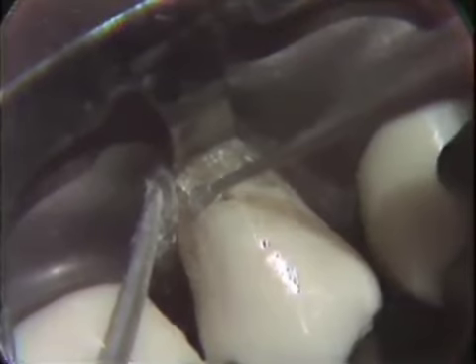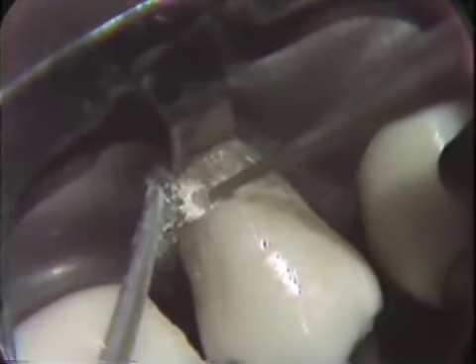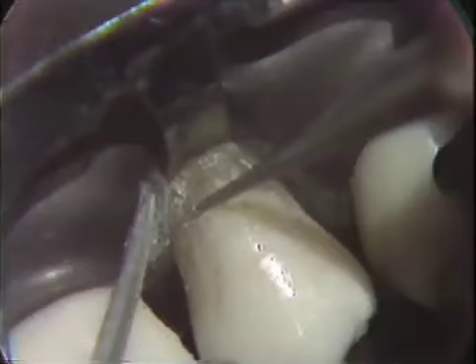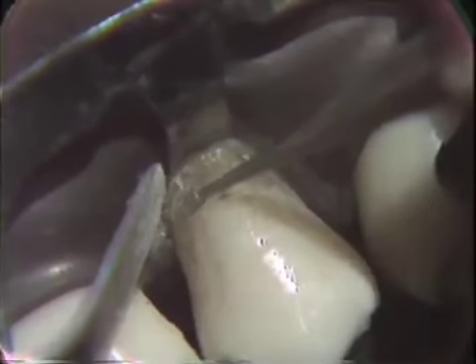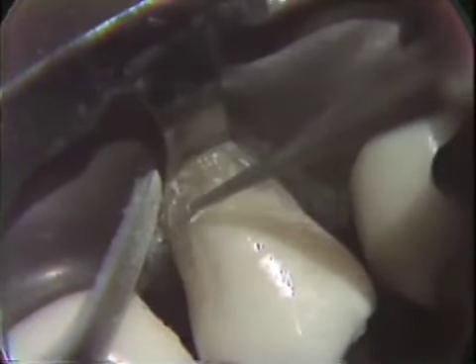Again, we're putting the base of the burr against that distal wall and the edge of the burr so that we are penetrating into dentin. And obviously the base of that burr is paralleling enamel rod directions. We know that there is the change in direction as we would take cross-section through that tooth.